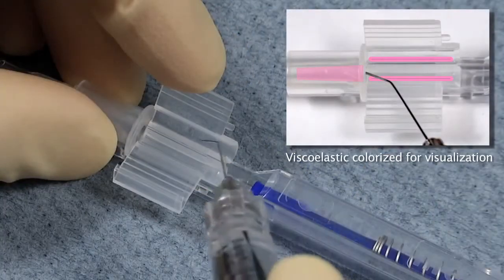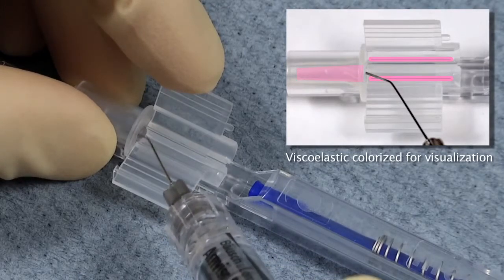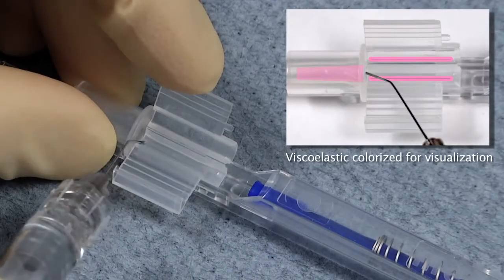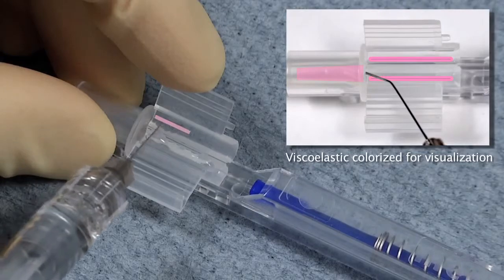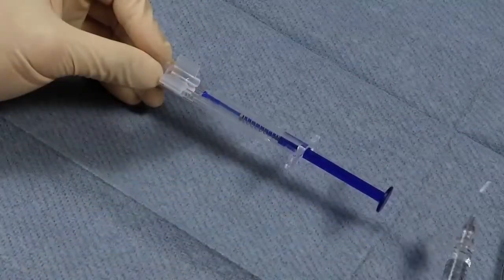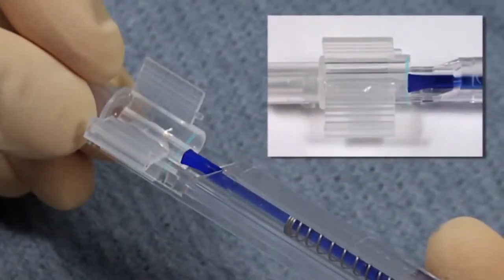Entering from the loading chamber side, apply Amvisc Plus or other Bausch & Lomb viscoelastic directly into the conical tip, and then apply two thin lines into the lateral grooves within the loading chamber. Now advance the plunger tip to the outer edge of the cartridge wings as shown.